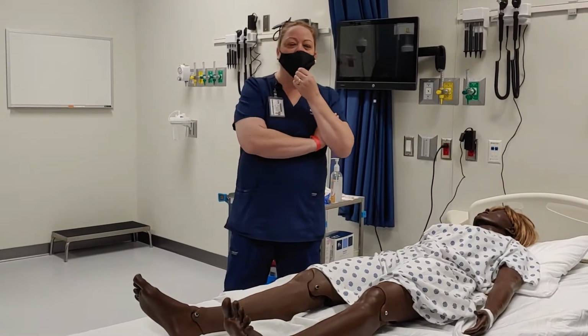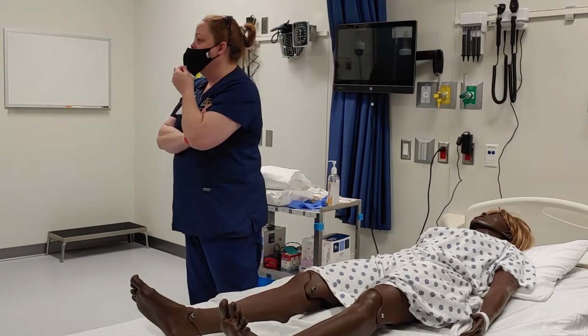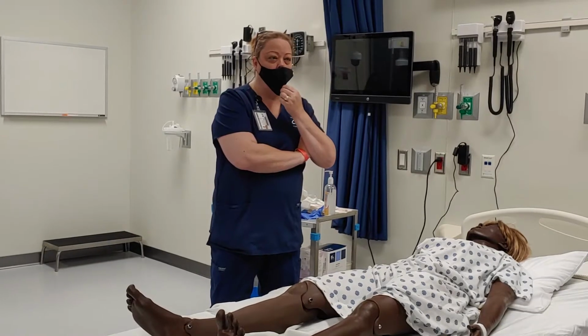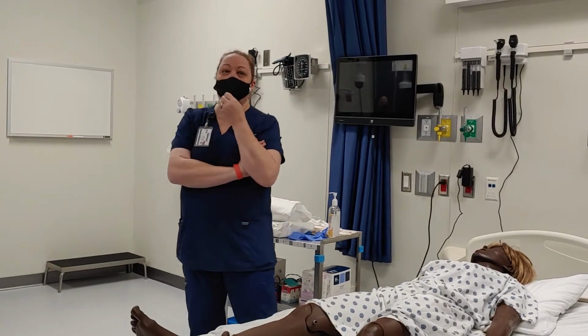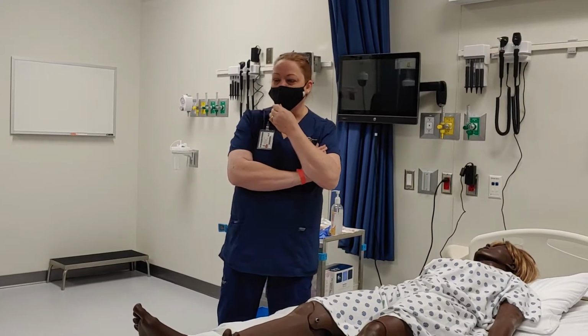So we don't want to leave it in there too long, because then they have the potential of getting a bladder infection as a result of it, because it's been in there too long, right? So those kinds are indwelling. They do stay, but we do have to change them periodically, okay, to make sure we maintain the sterility.